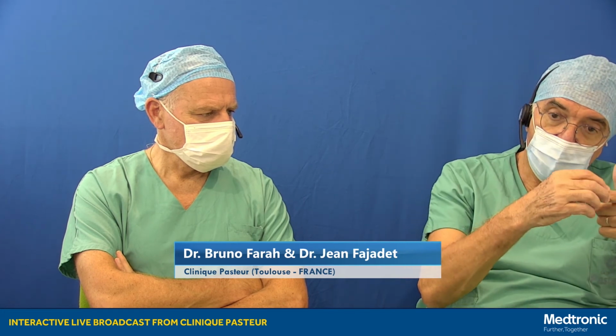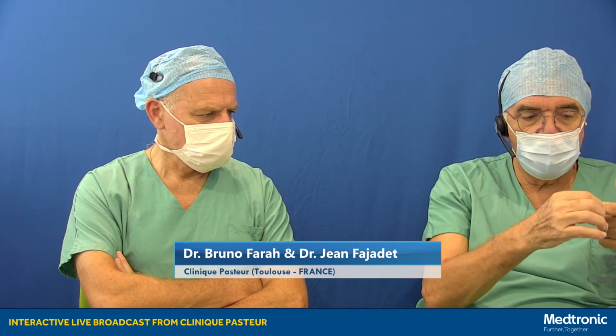It was a true bifurcation lesion, 1-1-1, but fortunately with a short, discrete severe lesion at the ostium of the diagonal and not a long disease. So we could treat it with a stent implantation in the main vessel, followed by the POT, followed by the kissing, and at the end, the result was good.